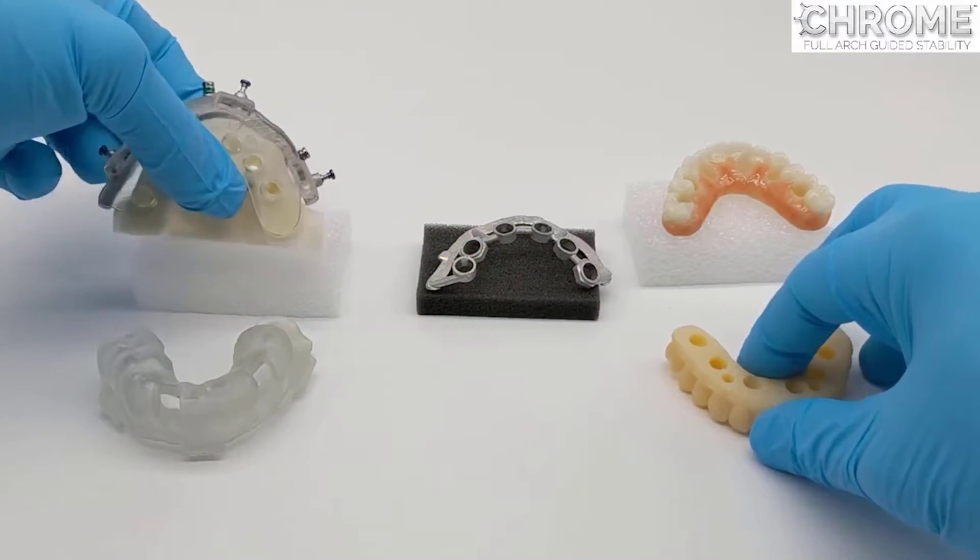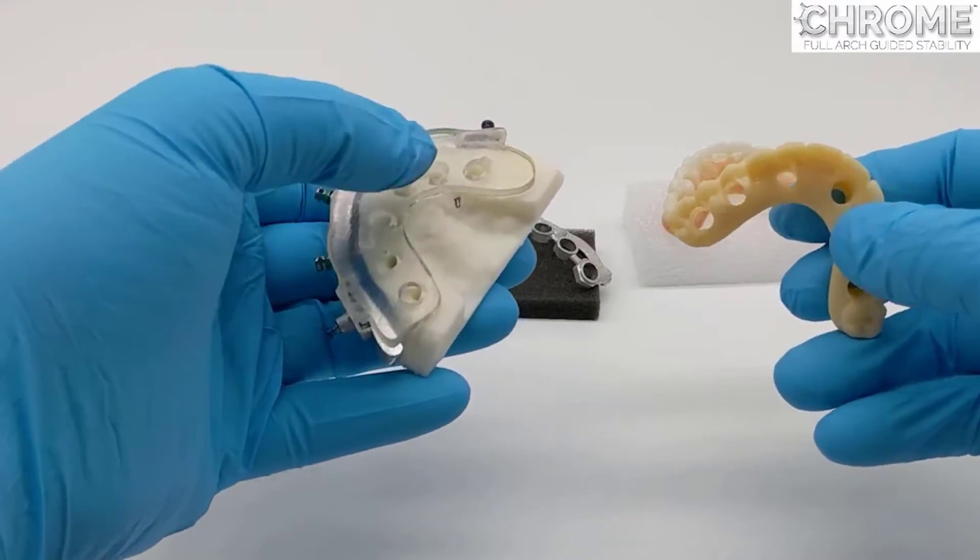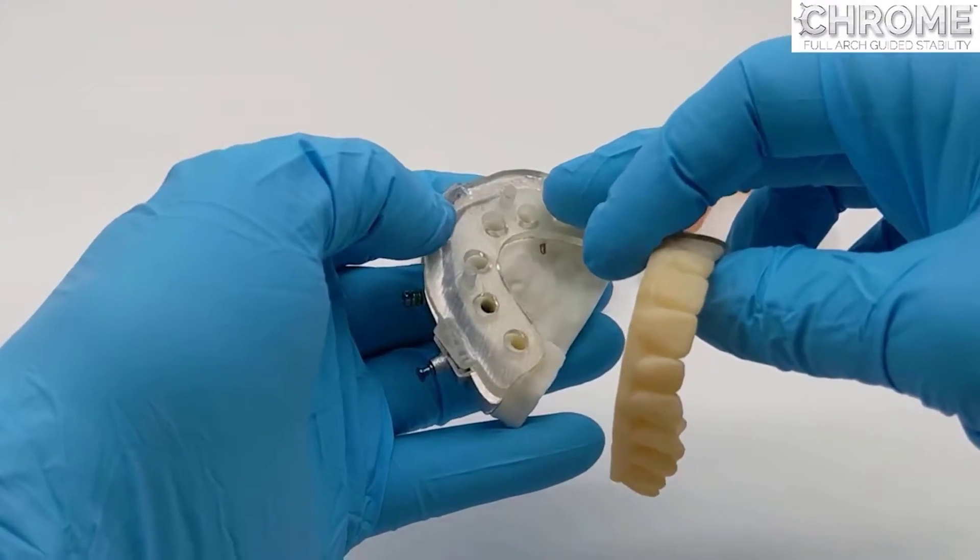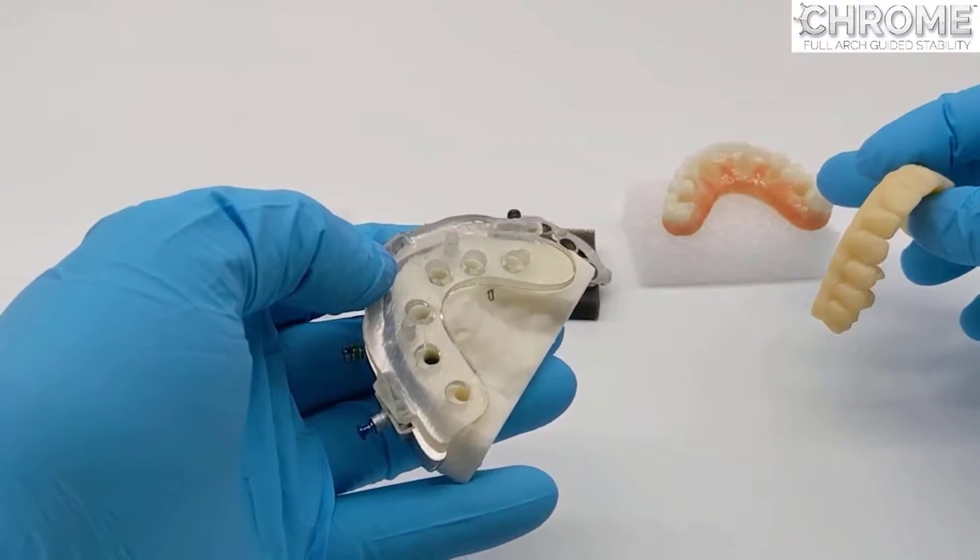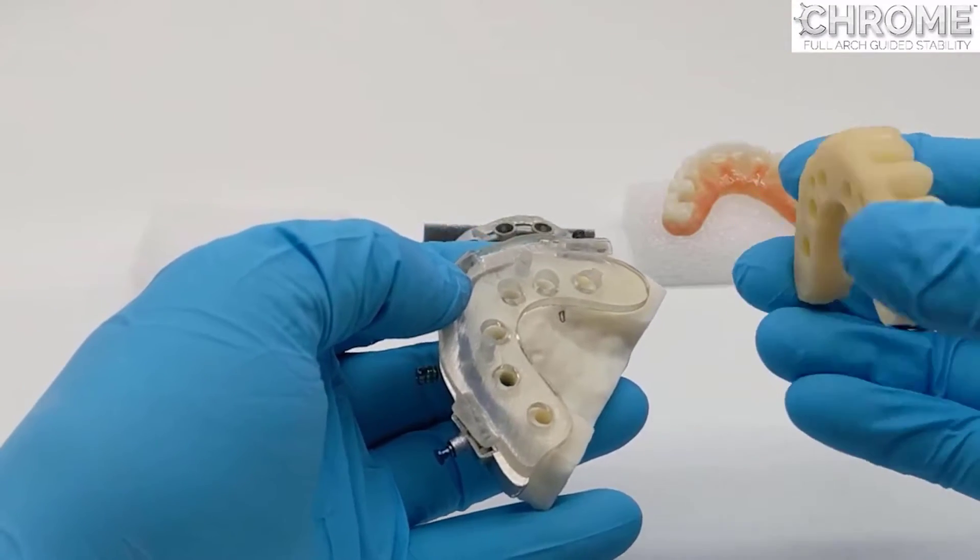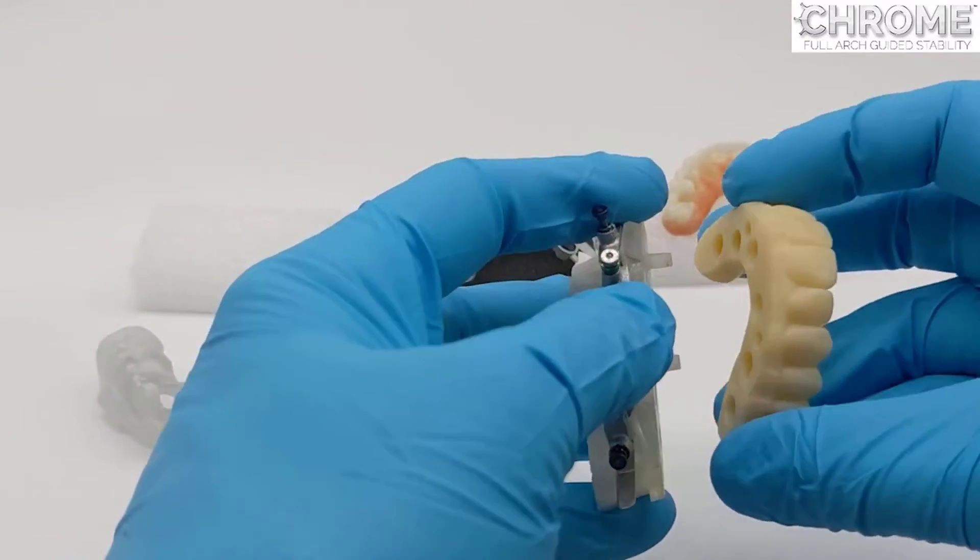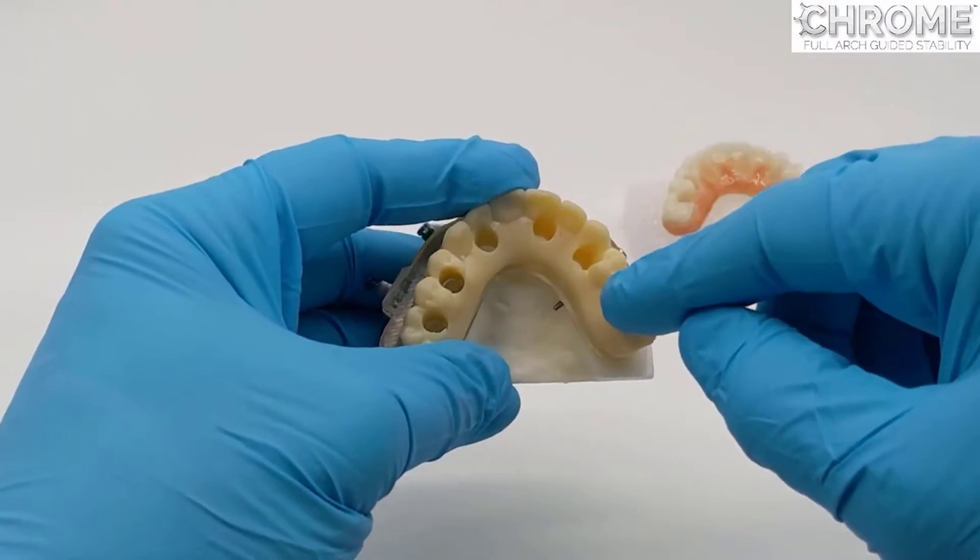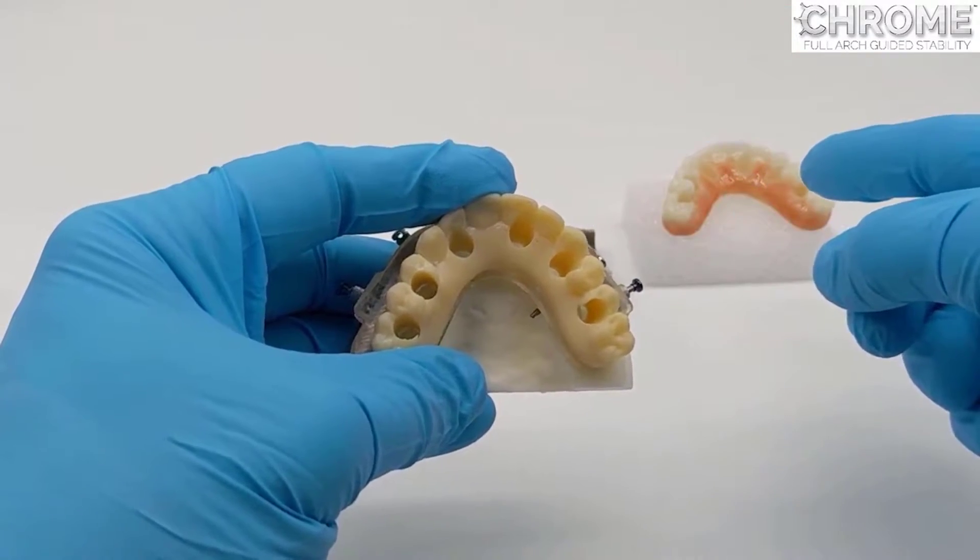One of the key features of Chrome Guided Smile is a dual pickup process. The carrier guide supports the long-term prosthetic and also supports the duplicate monochromatic rapid appliance. The rapid appliance seats on the carrier guide and you will perform a second pickup just like with the prosthetic.